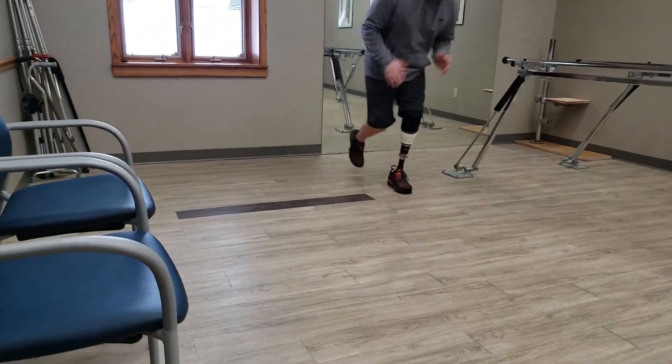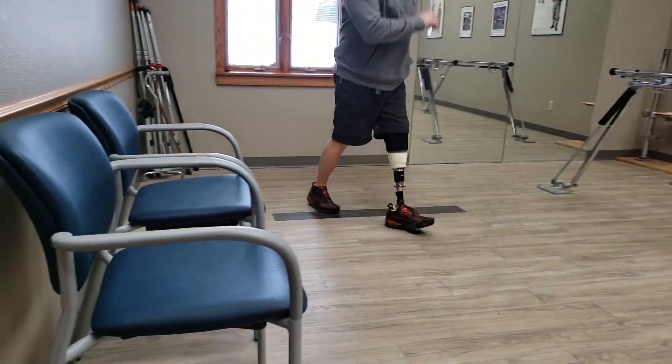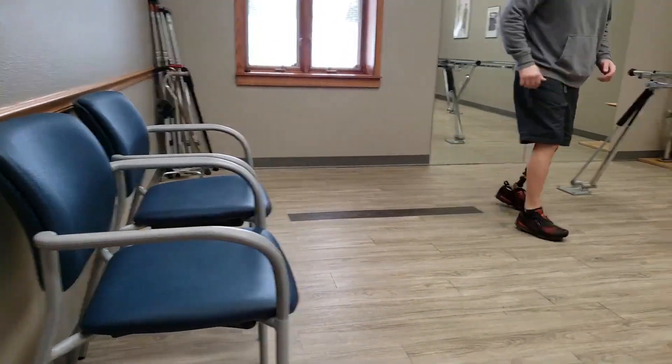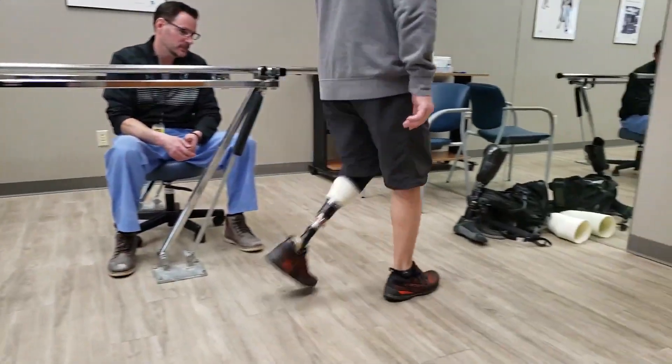This portion of the fitting process is by far the most important and at times can take hours and even days to ensure that the physics of the prosthesis match what the patient is feeling and the desired outcome.